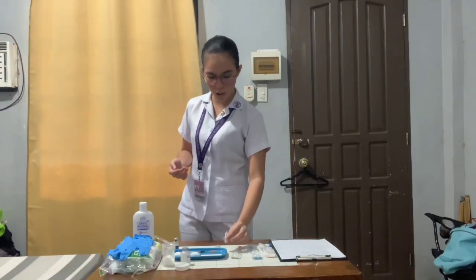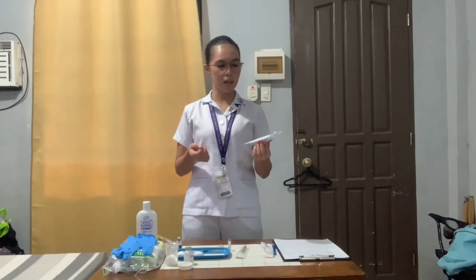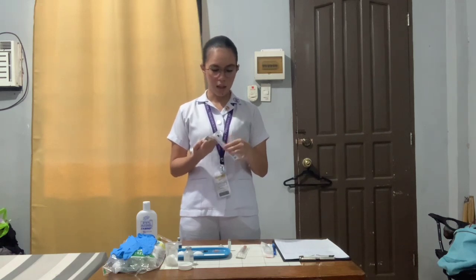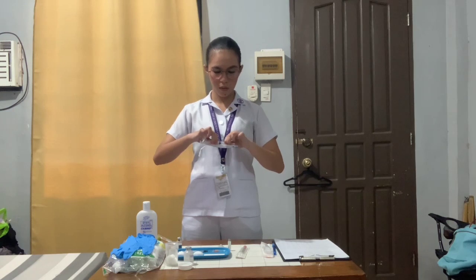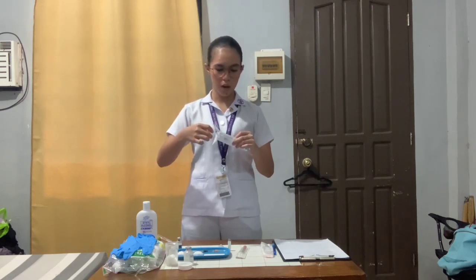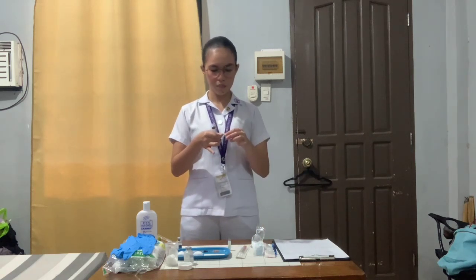Now that our ampule is ready, we're just going to put this on the table, and then we're going to prepare our syringe. We'll be using this 5cc syringe, so I'm just going to open this, and then I'm going to unattach the needle tip of this syringe, and then I'm going to get the barrel and attach it to the filter needle.